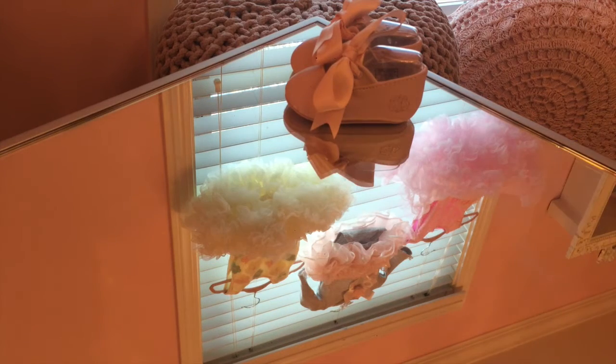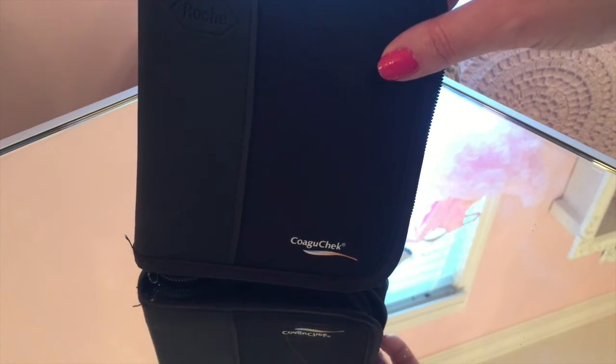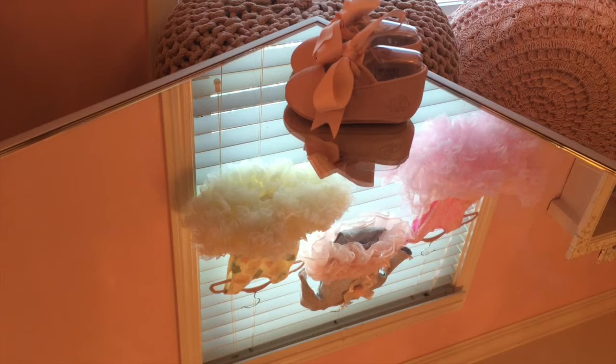Hey guys, it's Prissy. Today I am checking my INR and I thought it might be a good idea to film this in case there's someone out there that just got a machine and needs to know how to use it. So I'm going to actually check my INR on camera.